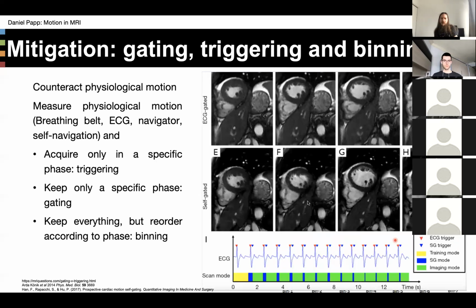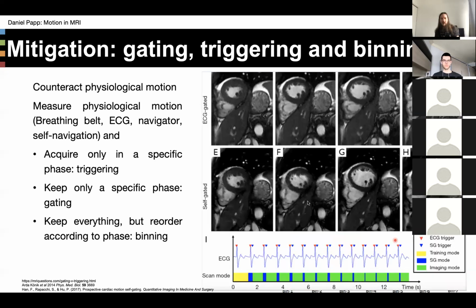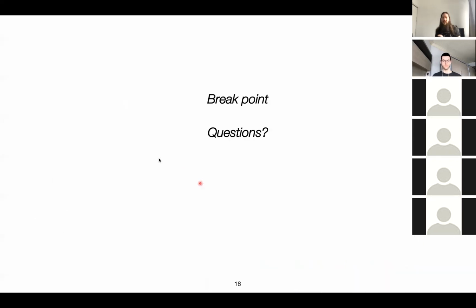And for example, most of these examples come from abdominal or cardiac imaging because that's where you're most affected by it. People always breathe, people always have a heartbeat, hopefully. And you can get really nice looking cardiac images, I think this is the short axis view, using, so this is ECG gating. So there's a little ECG on the person's finger, and that's what's helping them trigger, and this is self-gating, which we'll come back to, but this just means that it's fully MRI data-driven gating. Whew. Okay, enough about that.